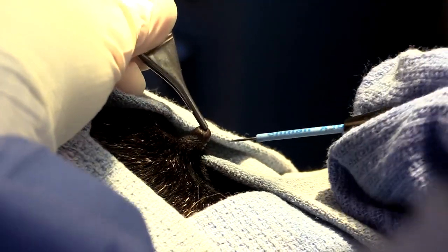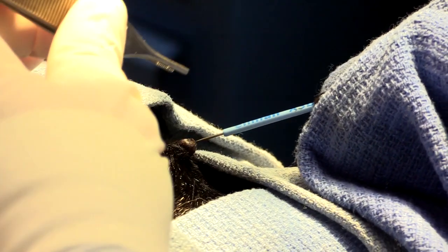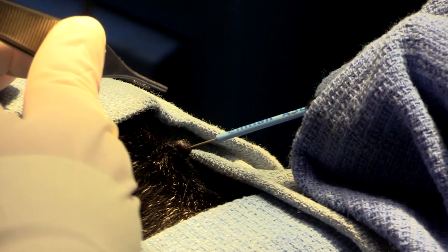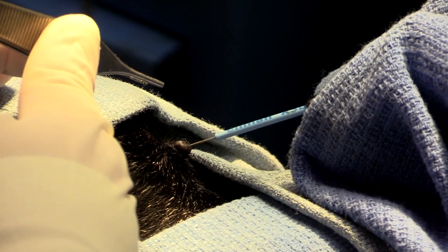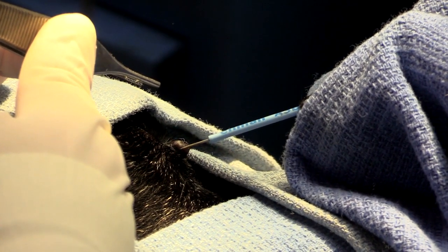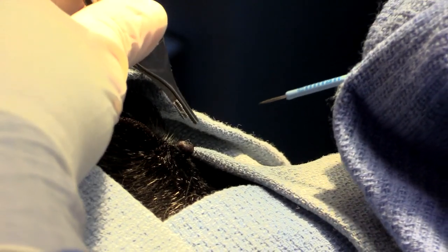Ordinarily on any mass I would like to get at least a one to two centimeter margin, but since this is so close to the eye, there's not going to be a way I can do that at this point. So what I'm going to do is just take it at the base and send it off, and if it's something like a melanoma, then we can always go back and take more skin if we need to. This one's relatively straightforward.